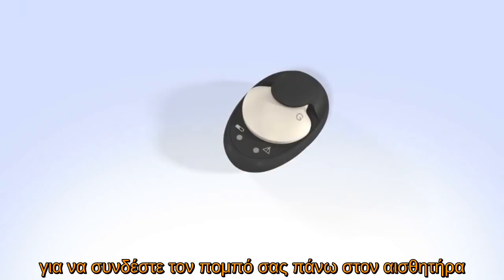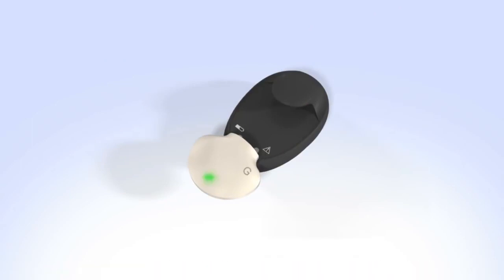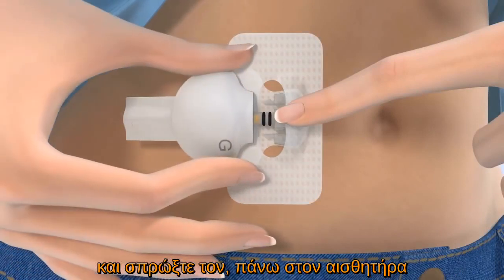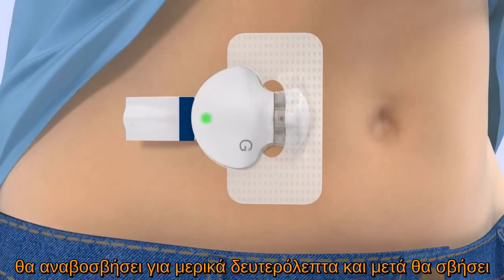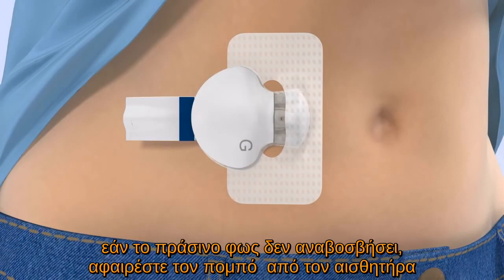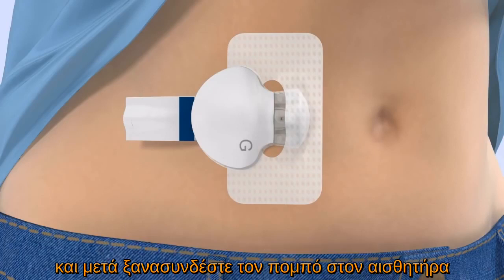To connect the transmitter to your sensor, remove your transmitter from the charger and watch for the green light to flash. With one hand, hold the sensor in place. Hold the transmitter with your other hand and push it onto the sensor. It will click when it is connected. The green light on the transmitter will start flashing within 10 seconds, flash for a few seconds, and then turn off. If necessary, use a mirror to see the green light. If the green light does not flash, disconnect the transmitter from the sensor and place it back on the charger until it is fully charged, then reconnect the transmitter to the sensor.